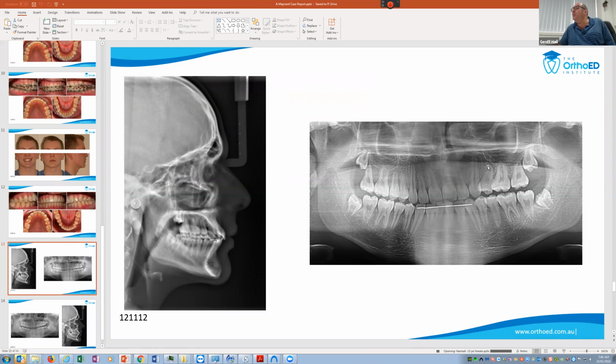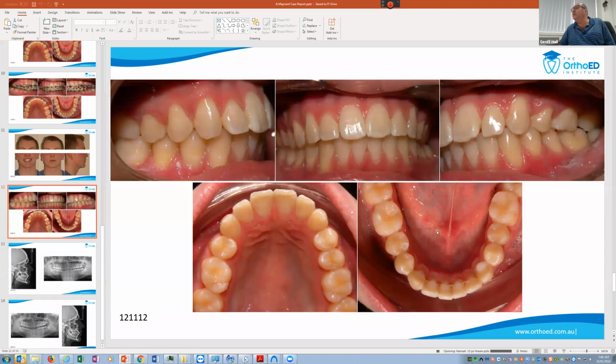The root could be moved a lot more easily according to this OPG, right? But when I look at it, it looks pretty good to me. Upright, yeah. It looks pretty good. I mean, I could probably have rebonded a little bit better, but it's not a big deal. But the purists would once again say that.